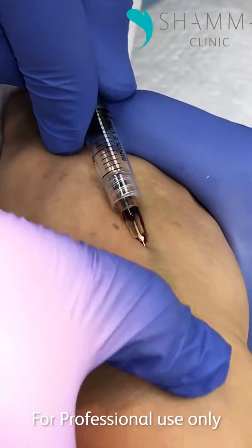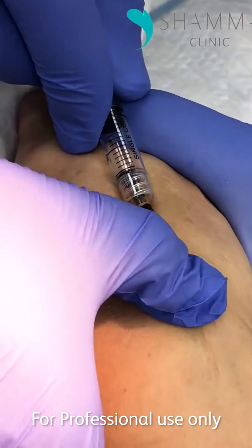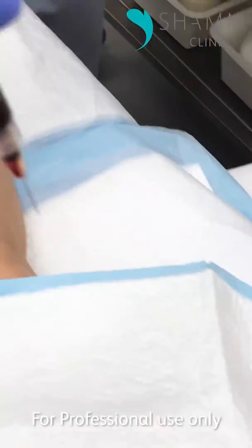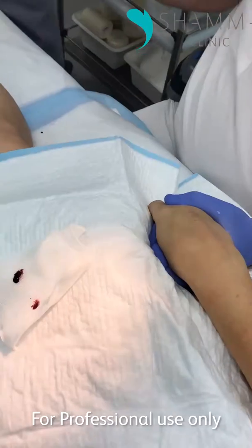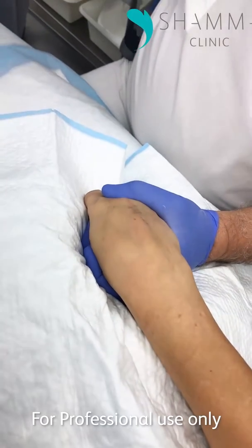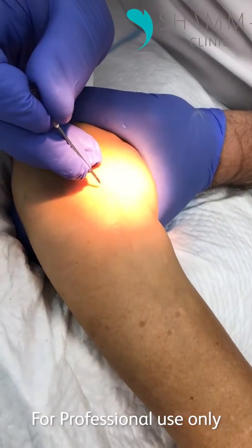I think very few vascular surgeons use this technique. Most surgeons use another technique, which I will show you. See — all of this is trapped blood inside. So the other technique, when this doesn't work, is to do it with an 18 gauge needle.